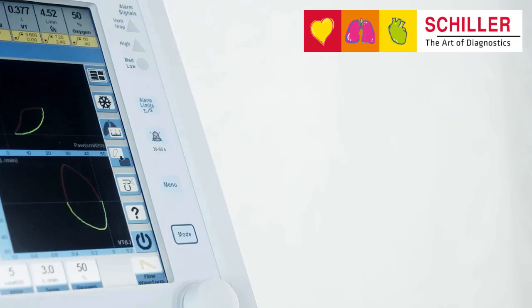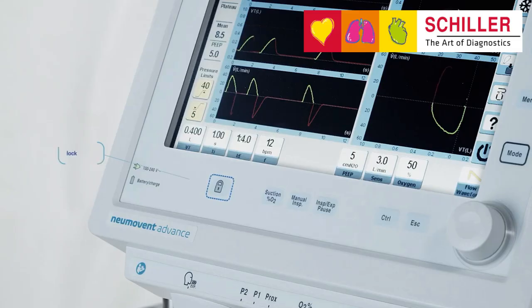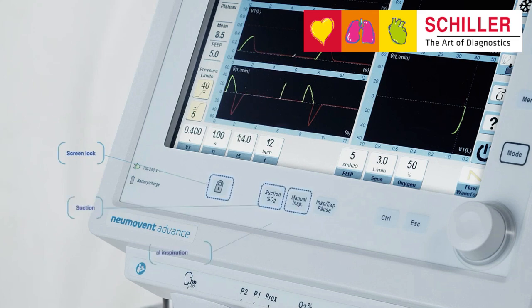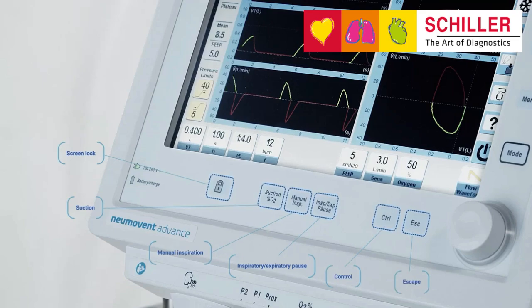Hard keys have the following functions: access alarm menu, silence alarms, access main menu, select operative mode, lock touchscreen, suction, activate manual inspiration, activate inspiratory/expiratory pause, control, and escape.